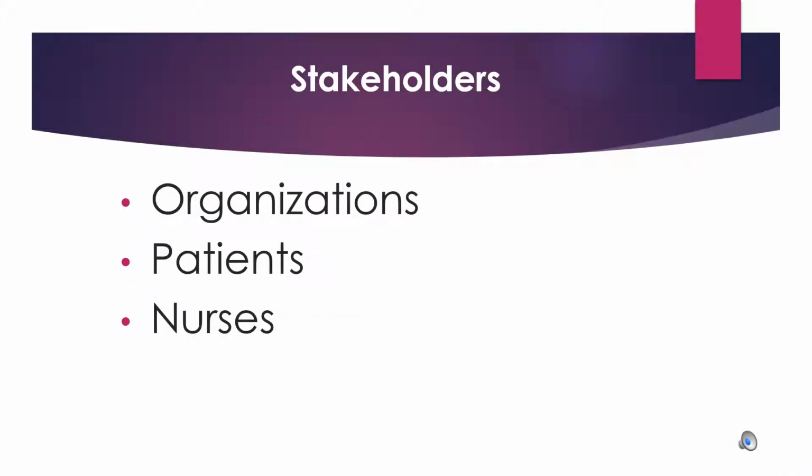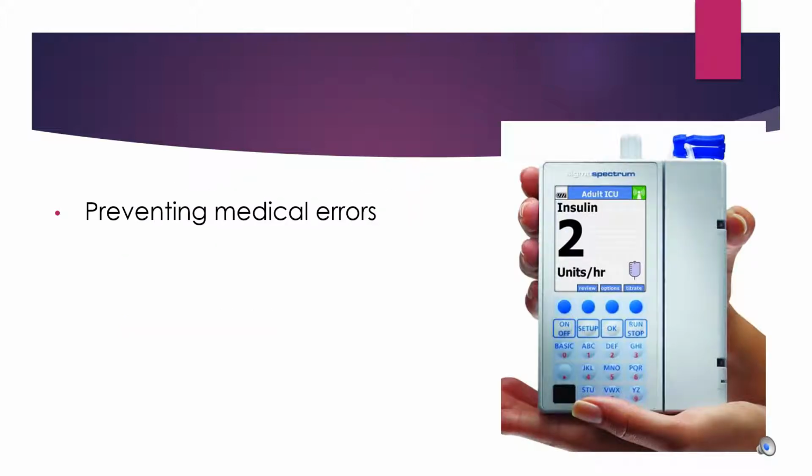Healthcare organizations, patients, and nurses benefit from intravenous and infusion therapy training, as it encompasses the initiative of quality, safety, and improved patient outcomes. Nurses are at the front lines of caregiving, and infusion therapy poses an increased risk to patients. There was a case study where a patient who received a heparin infusion received a fatal dose because the infusion pump had been programmed at 600 milliliters per hour instead of 600 units per hour. As nurse educators, we are responsible to educate student nurses as much as possible prior to getting into this situation. There have been reports of over 250,000 people losing their lives each year to preventable medical errors.